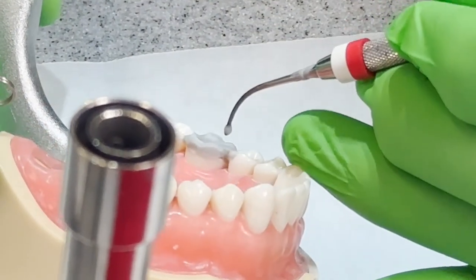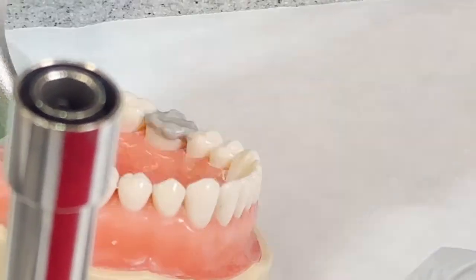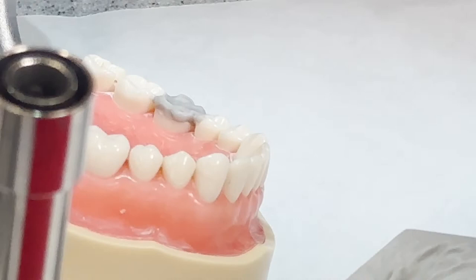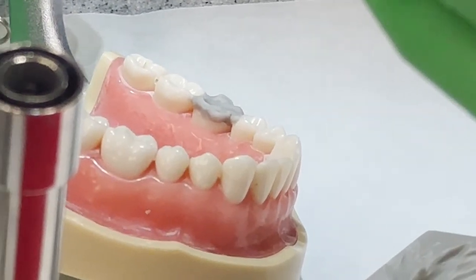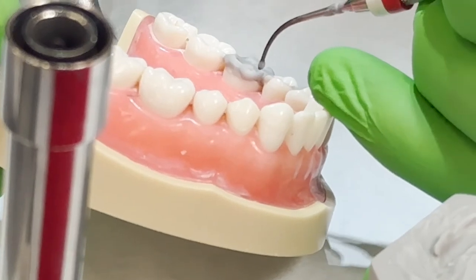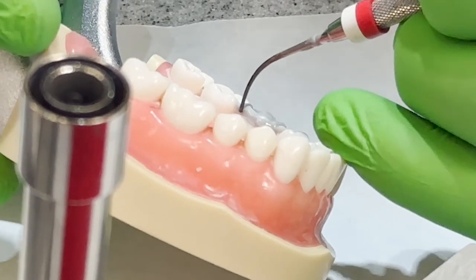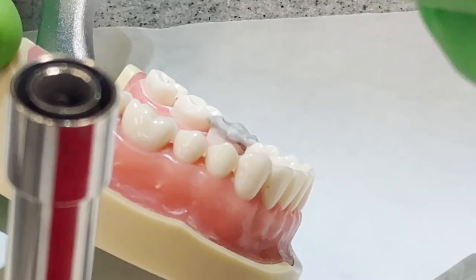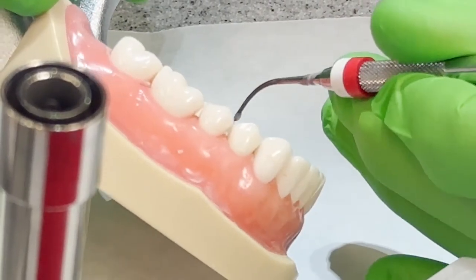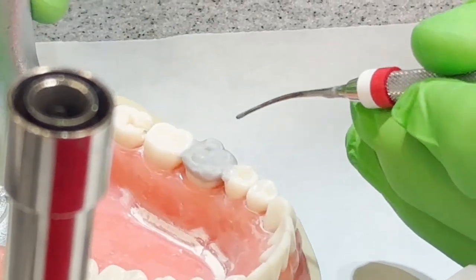As I look down it from the occlusal, I'm trying to get the shape of the occlusal view, and that should be becoming familiar to you guys since you've drawn this and you've waxed it. Okay.